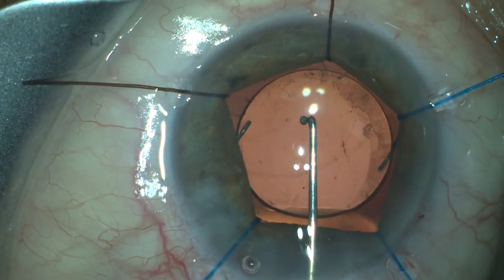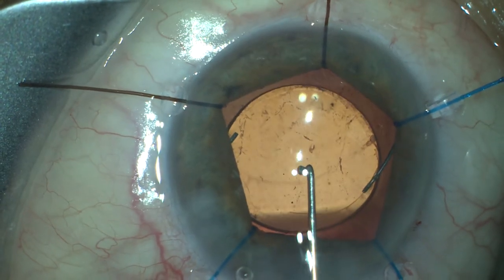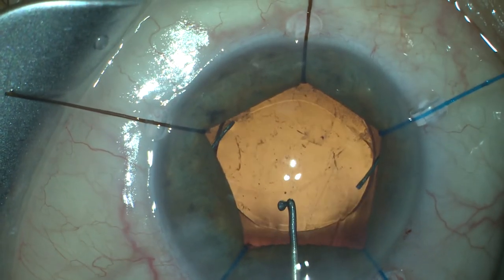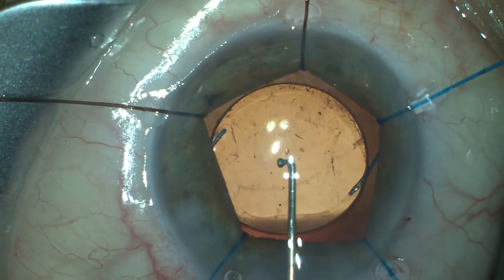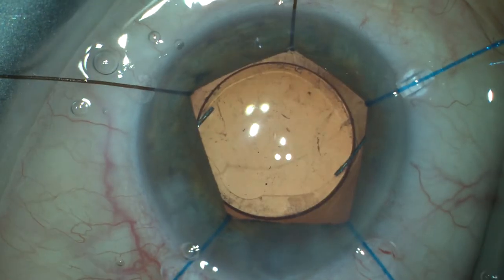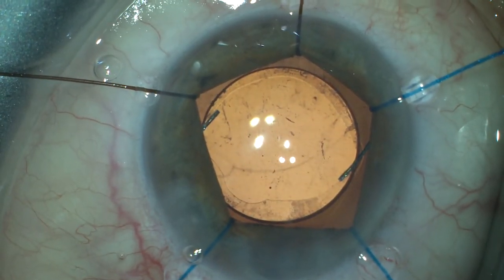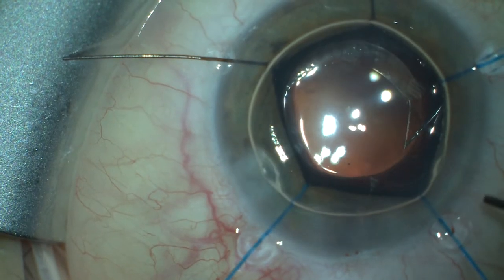After that we implant the lens. The loops are placed in the sulcus and we push the optic part of the intraocular lens into the bag. We aspirate the Healon in order to stabilize and secure the intraocular lens.